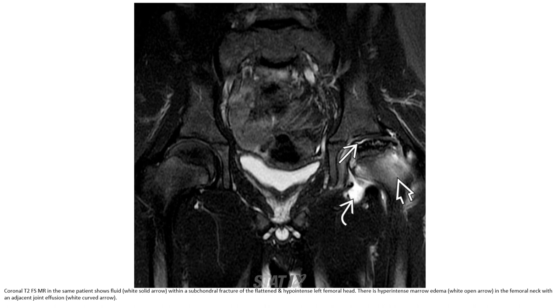This is MRI on the same patient. Fluid tracking to the subchondral fracture of the flattened and hypointense left femoral head. There is hyperintense marrow edema in the femoral neck, with an adjacent joint effusion.